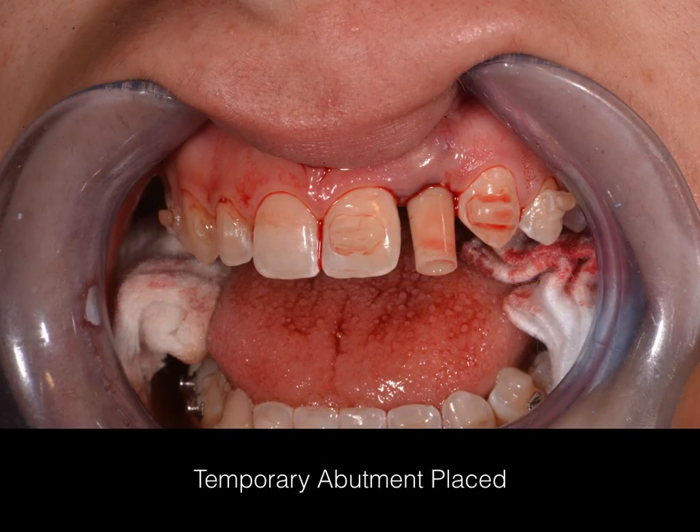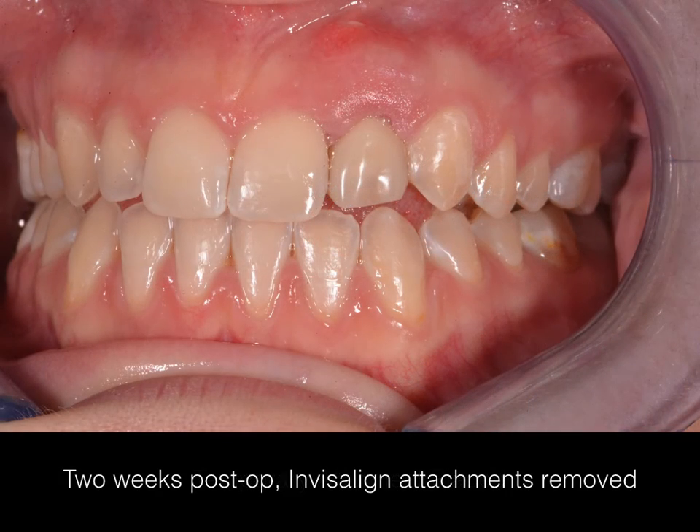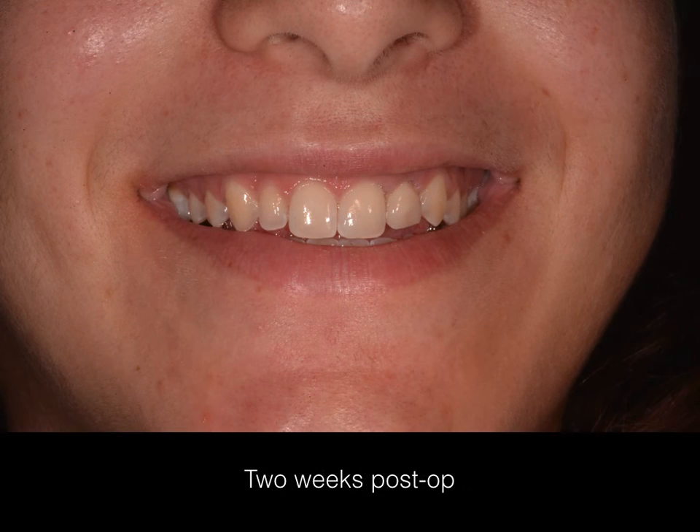This is a post-operative view with the provisional abutment in place. This is the two-week post-op view. The Invisalign attachments have been removed, as has the cinch suture — you can see a small region of erythema where it was just removed. You can see the convex nature of the soft tissue, and this is a full smile view with the provisional restoration in place.